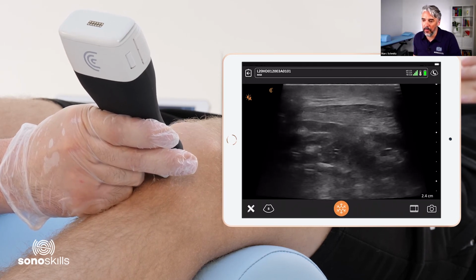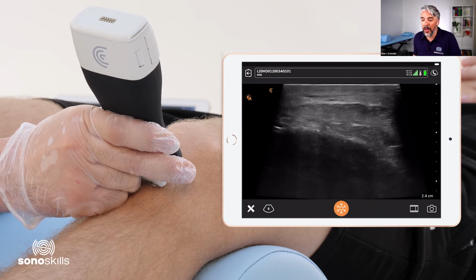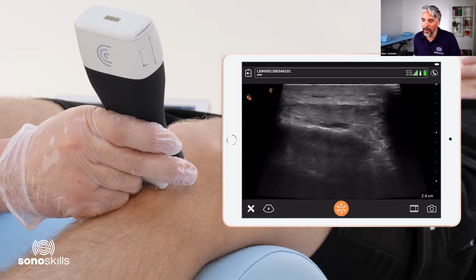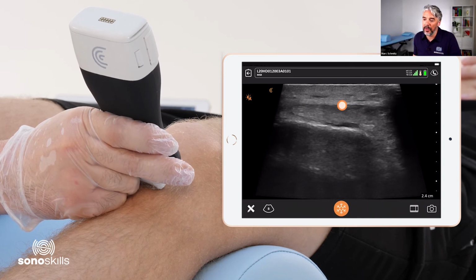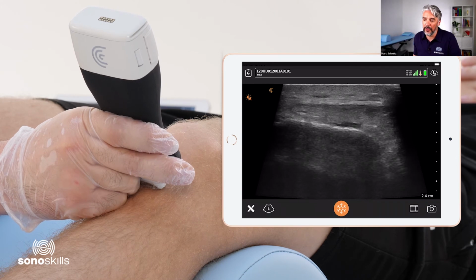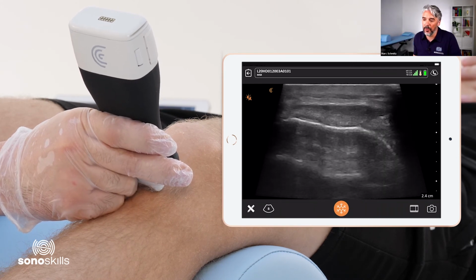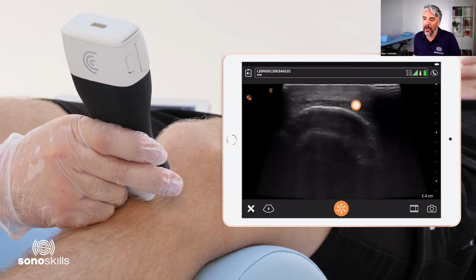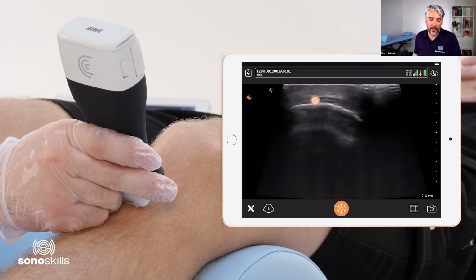That I will do probably right now. Yes, following it down to distal. And here you can see the tibia and some fluid again, the deep infrapatellar bursa right there. And we can see the insertion of the patellar tendon right onto the tibial tuberosity. And that is right here. So these are the last fibers, and there it's gone.